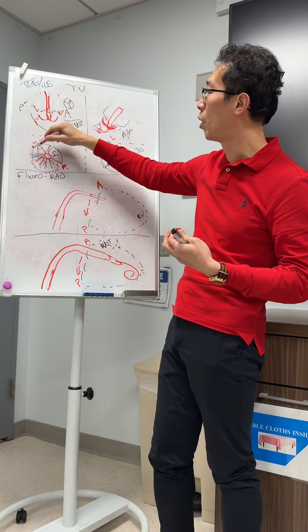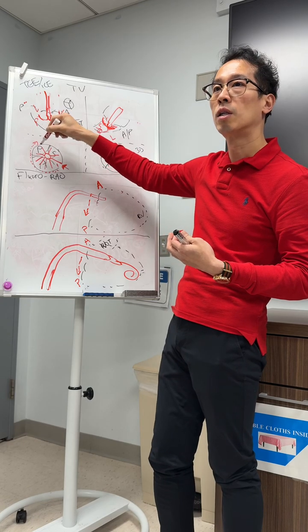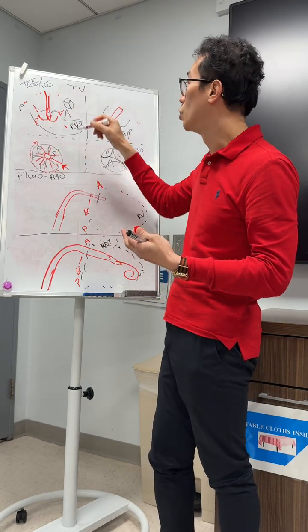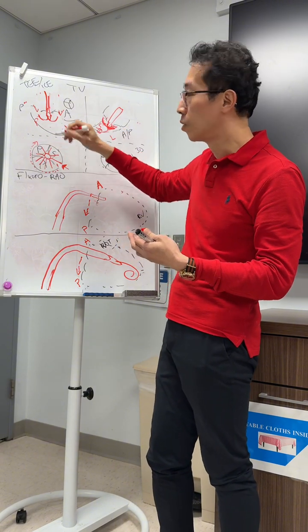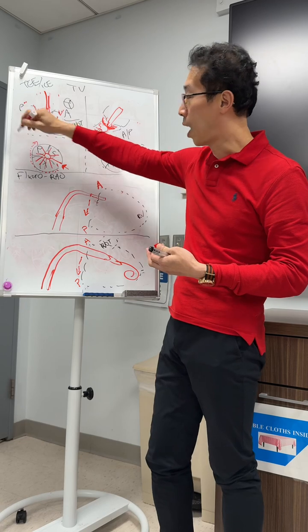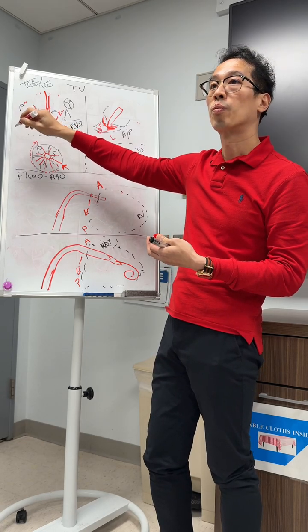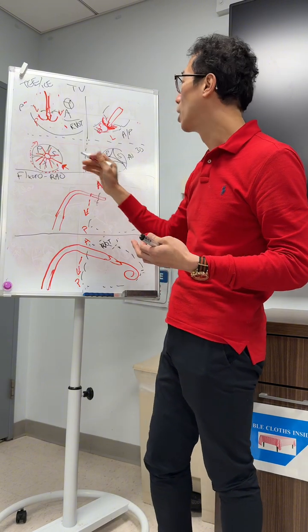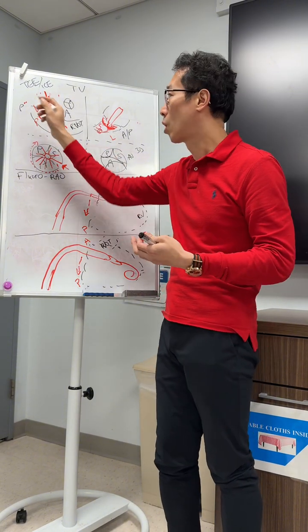But if you're having trouble on the opposite side, especially if you have leads or a commissure and you're not sure, you might be able to optimize the image first. That would be ideal. Or you can go across. In one of our recent cases, we had that challenge, and we were able to confirm by looking on the opposite side.